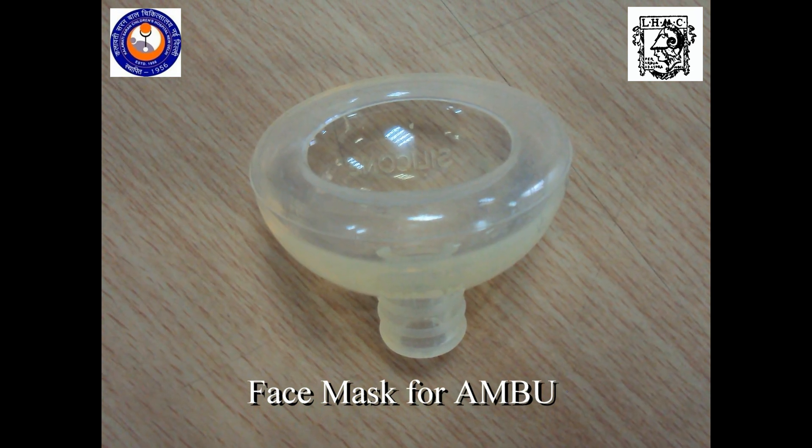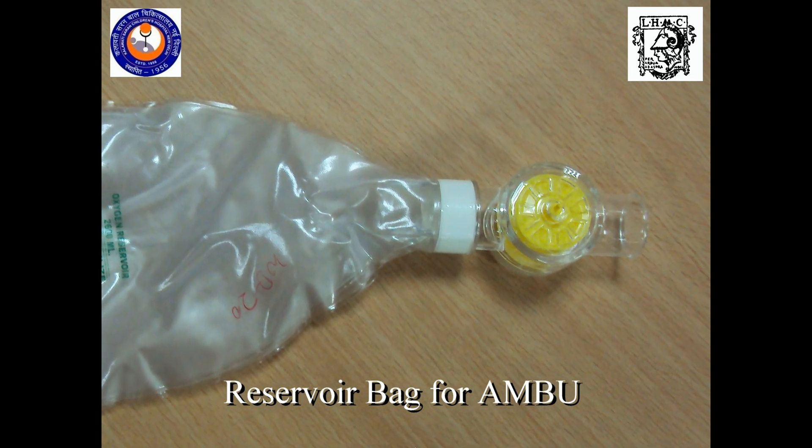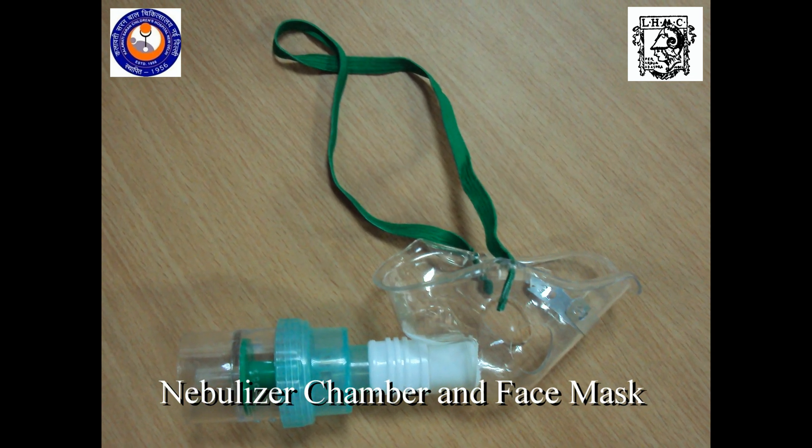Face mask for an Ambu, reservoir bag for an Ambu, nebulizer chamber with a face mask.